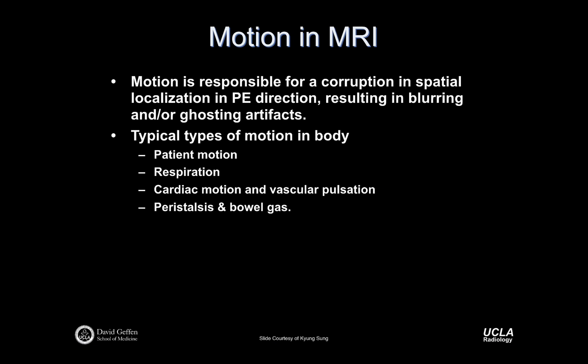And cardiac motion, or otherwise vascular pulsatility and so forth, can also be monitored, and imaging can be synchronized to it. Again, Holden will talk about this a little bit more, but what do you think is the easiest way to synchronize imaging to cardiac motion? How would you think about doing that?